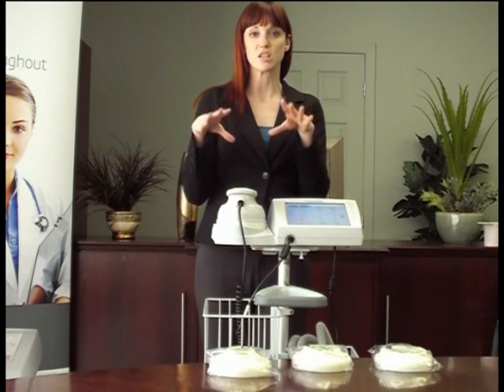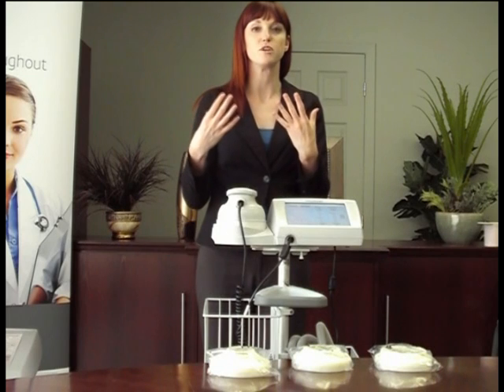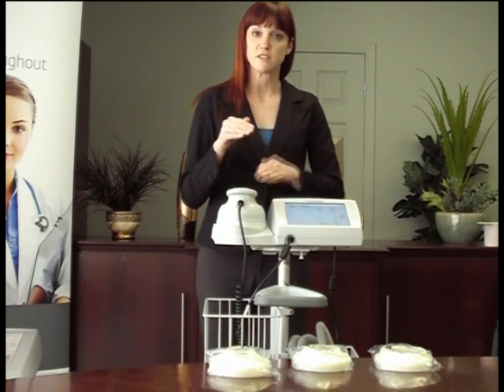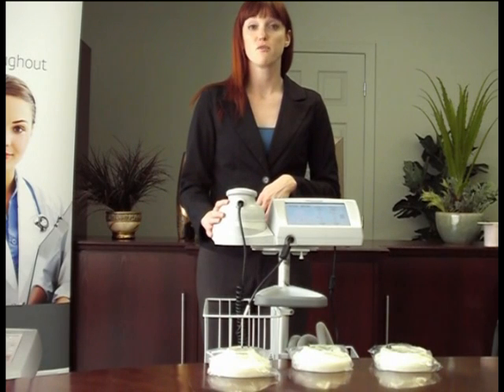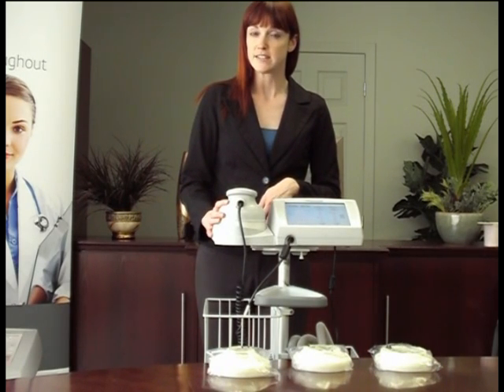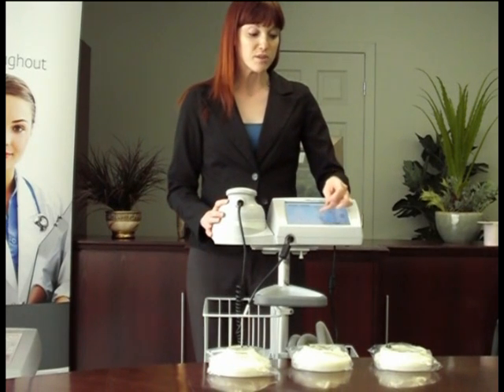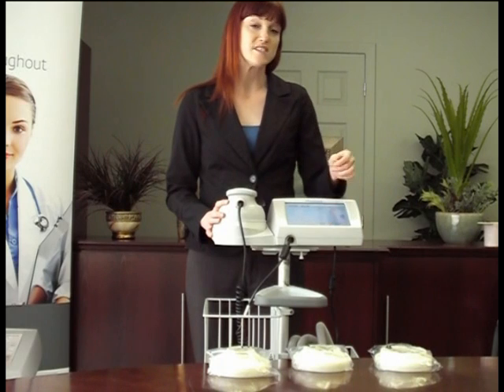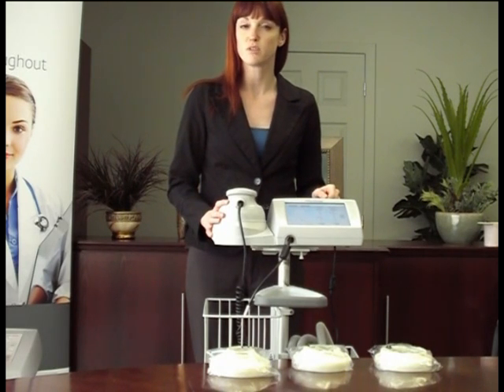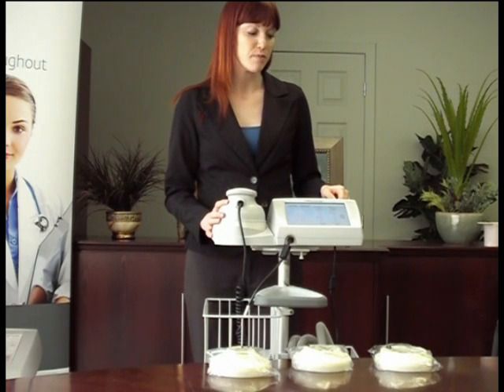So when we do airway clearance techniques, mainly what we're trying to do is to generate a frequency. So when we do chest PT, we generate 4 to 6 hertz. The vest goes from 12 to 19, while percussors are around 15. With the Frequencer, we start at 20, but since we know the optimal frequency is around 40 to 42 hertz, we're going to stay in that range for the therapy.